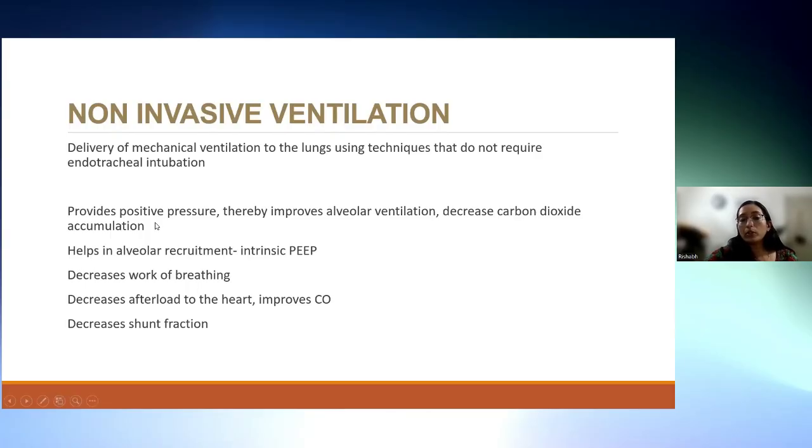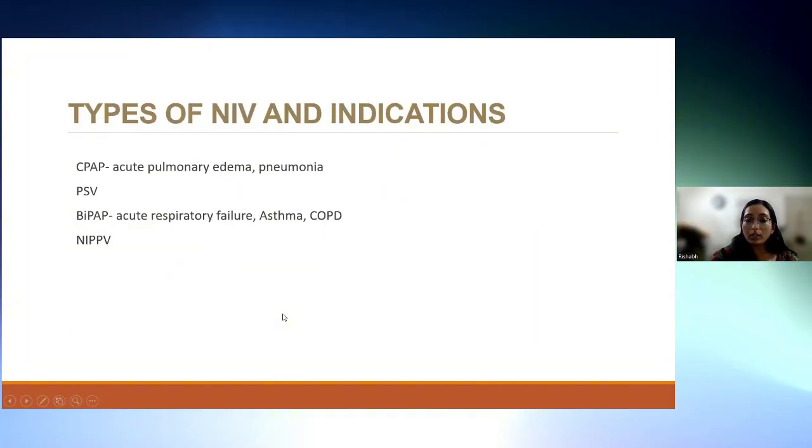Here, positive pressure is produced and provided, and that improves the alveolar ventilation. It decreases the carbon dioxide accumulation. It helps in alveolar recruitment and thereby intrinsic PEEP. It decreases the work of breathing. It decreases the afterload to the heart.